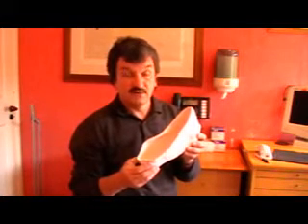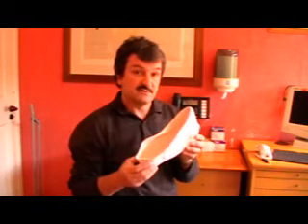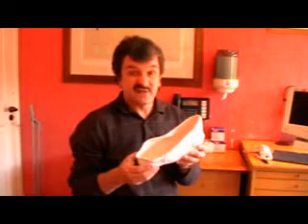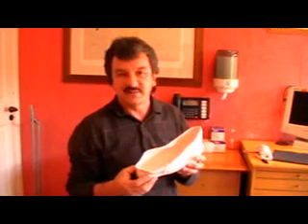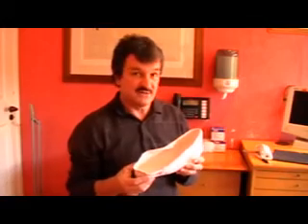That is how to take a cast properly. For further information, visit our website www.biomechanicsfootlab.com for further educational videos. Of particular interest is our cast evaluation video that goes with this one. Our cast evaluation video provides you with 10 simple steps to evaluate your own cast. Use the 10 steps to refine your casting technique. Remember, better casts give better results for your patients.